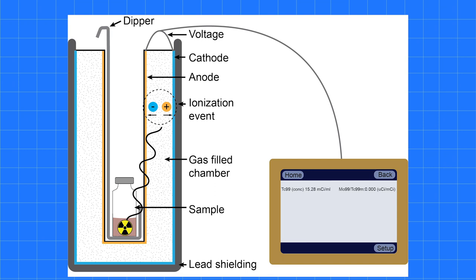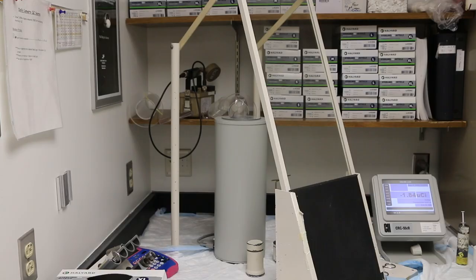Once a radiation source is added to the dose calibrator, current flows, providing a measurement of the radioactive dose. Bring the lead-lined canister to the L-block and place the container behind the shielding.